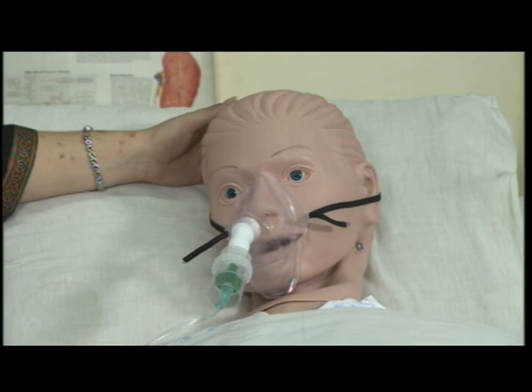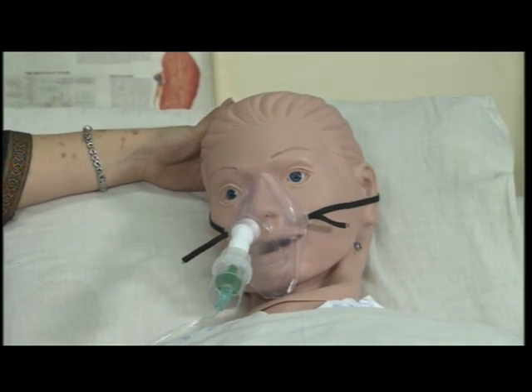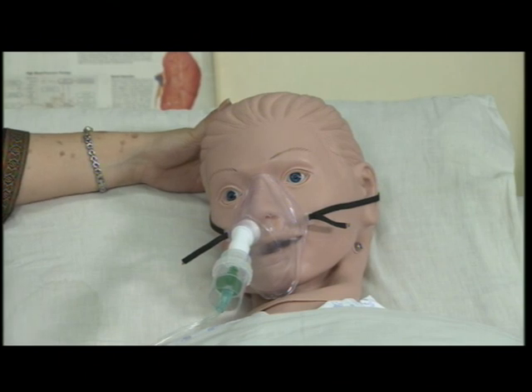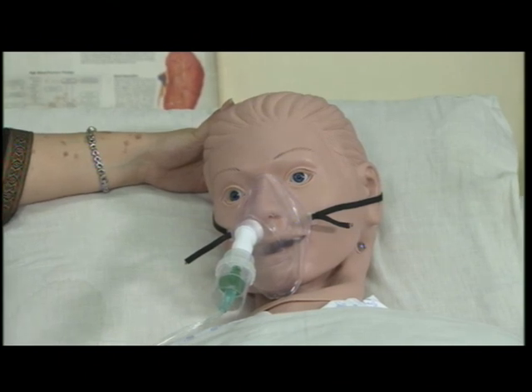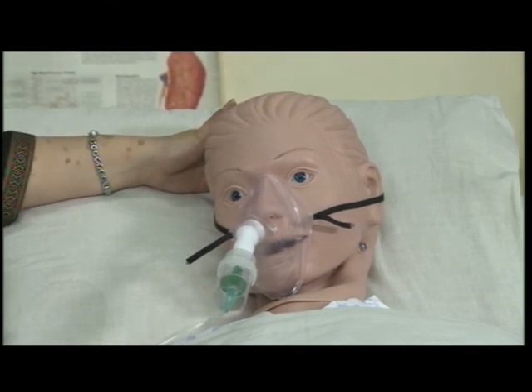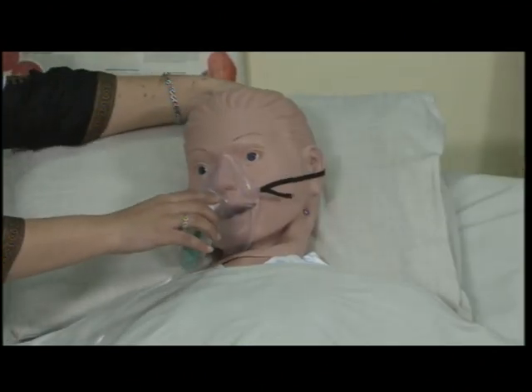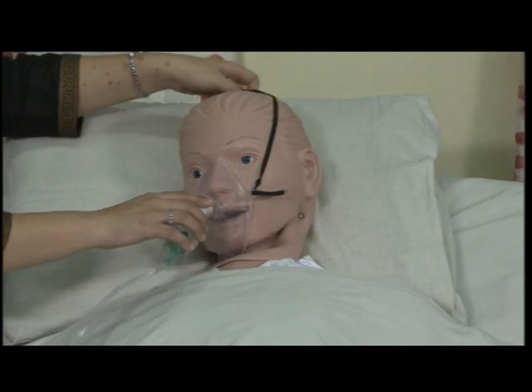The nurse asks the patient, Dolly, are you receiving oxygen? The patient confirms yes. Now we have given the prescribed amount of oxygen to the patient.